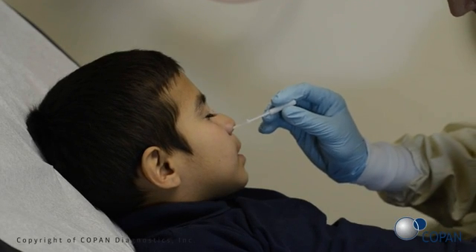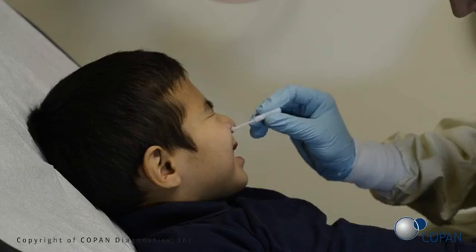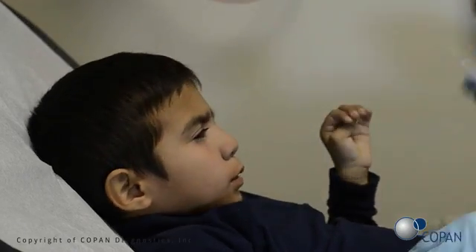Using a gentle rotation, push the swab until the stopper meets the patient's nose and a slight resistance is met at the level of the turbinates. Rotate the swab several times against the nasal wall.